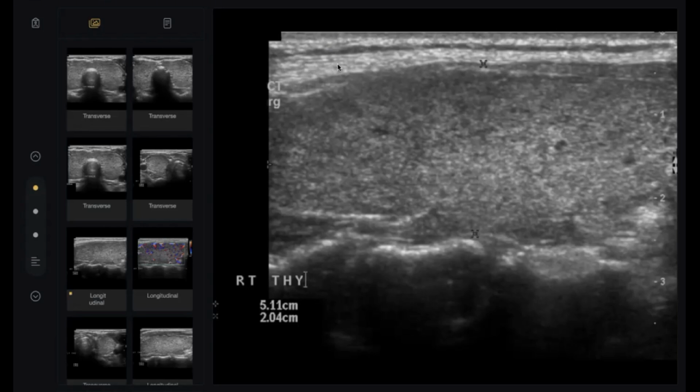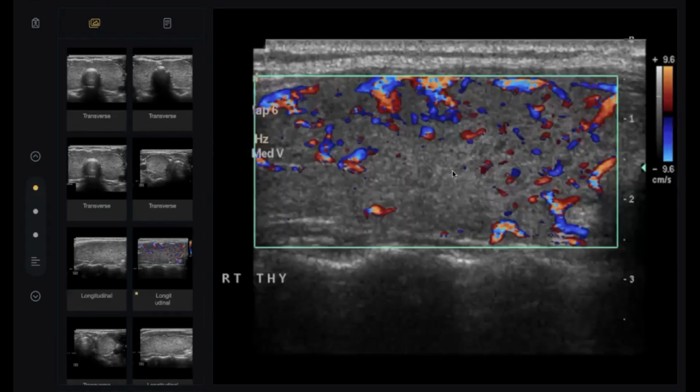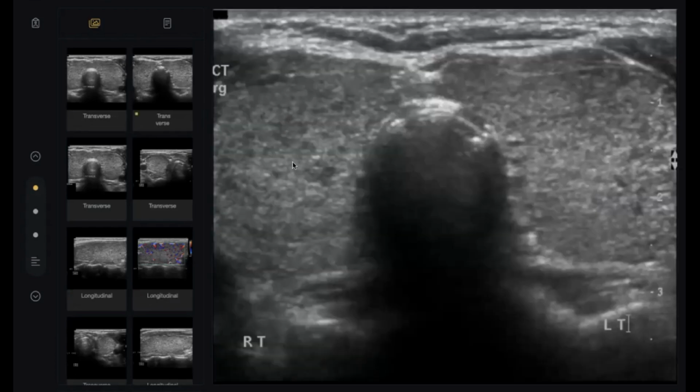Look here. This is the skin and subcutaneous tissue. It looks like some echogenic nodules, similar to here. This is a harsh image, but generally all the thyroid is similar. And this is a blood vessel. Look, blood vessels. Generally, if you tell the examiner it may be thyroiditis, maybe Graves' disease, he will be happy. This is not a matter of conflict. Finally he will do his labs.